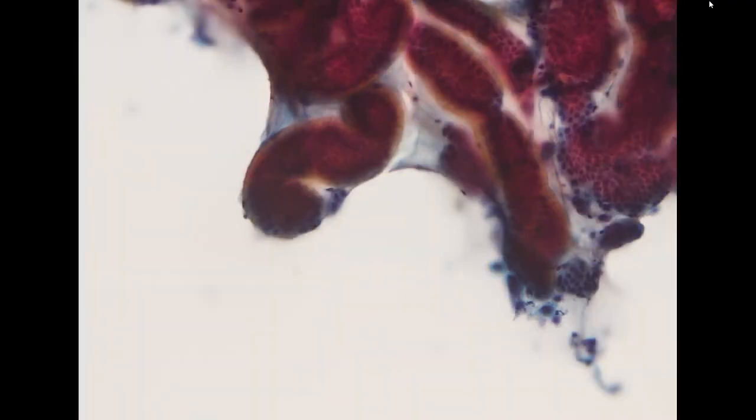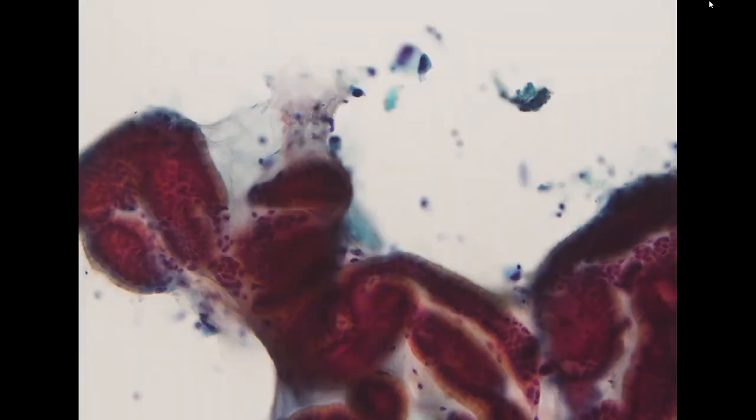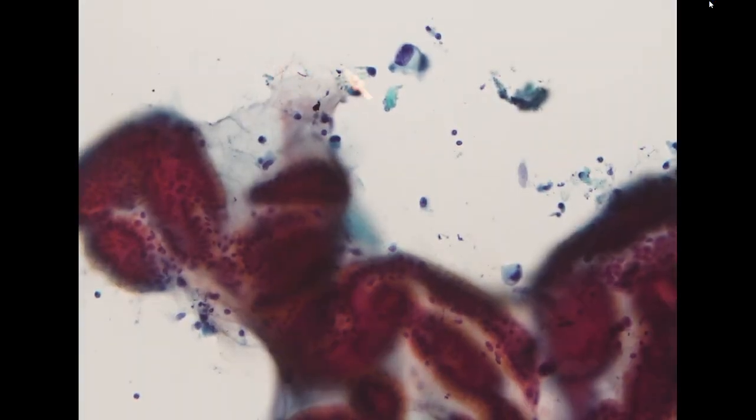So these are well differentiated mucinous cells with mucin secretion. In this situation, you will think about, could it be a well differentiated mucinous carcinoma, or could it be an IPMN? However, in the adjacent area, we already see these high-grade cells. So these are diagnostic for adenocarcinoma.